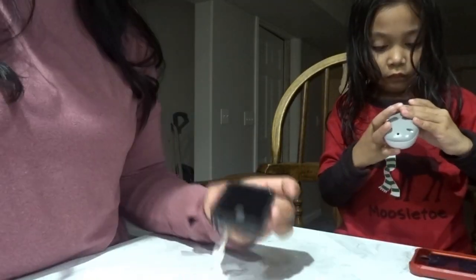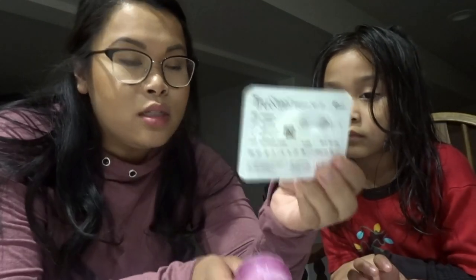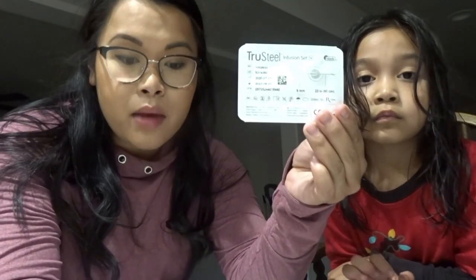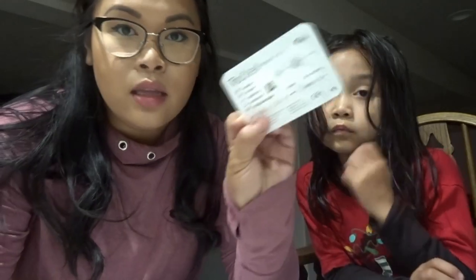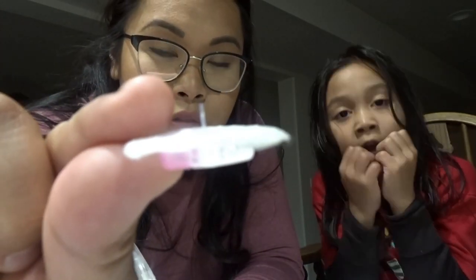Now we're going to do the pump. This is the Tandem t:slim pump - Emma's had this for two years and we really like it. We've tried different sites - we've tried the True Steel, which we like, but it hurts Emma a little bit. Then there's the AutoSoft - the difference is that the True Steel has a metal needle and metal cannula, while the AutoSoft has a plastic cannula.